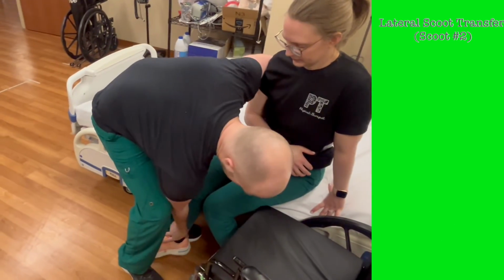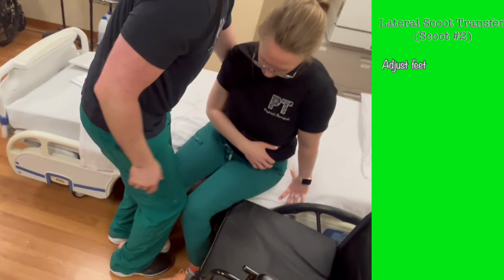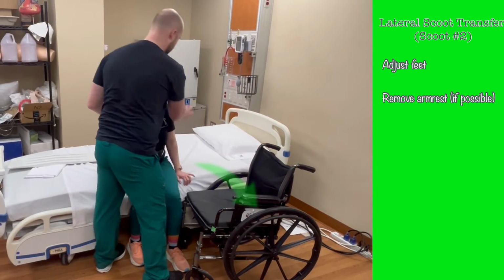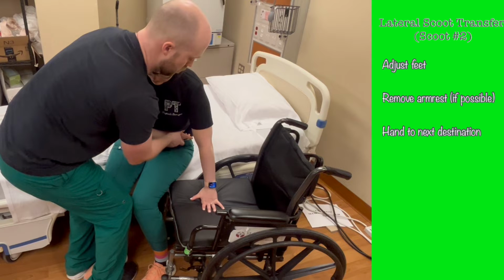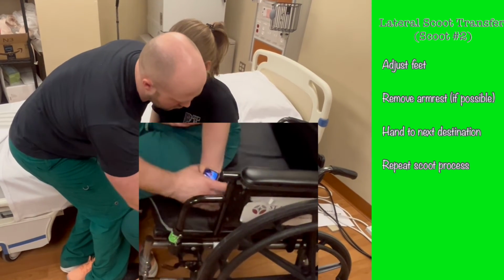Before performing another scoot, check to make sure the feet are still positioned correctly, and reposition them if necessary. Remove the arm of the wheelchair if it is removable. This gives an unobstructed path to the final destination. Then place the strong hand on the seat of the chair, the stopping point for our next scoot. Follow the same steps as with the previous scoot and guide the patient onto the chair.